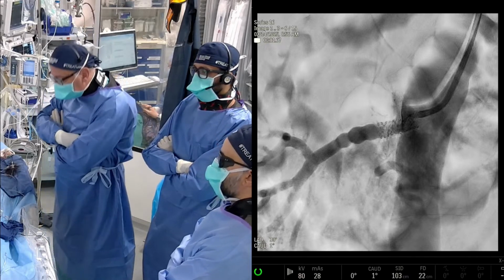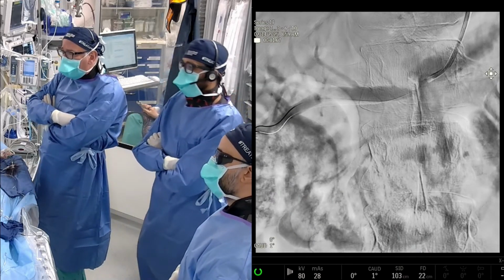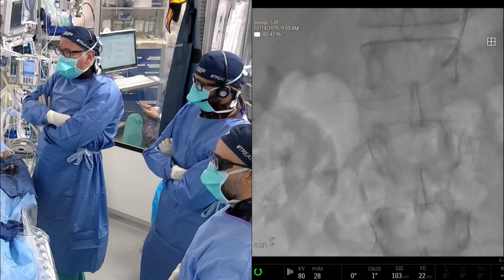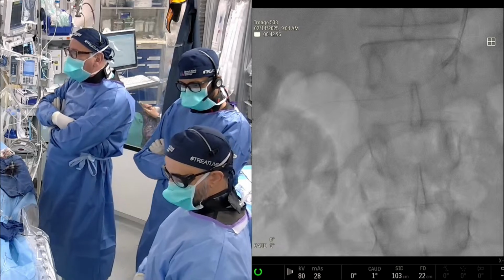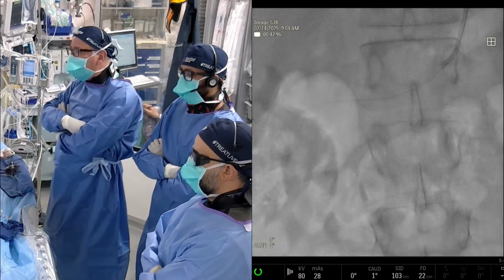We then drew our attention up to the main right renal artery, and that's where we are right now. I'm going to basically go live with the intravascular ultrasound so we can see and talk about it. The working wire, and I might have mentioned this before, we have an FR4 6 French guide.